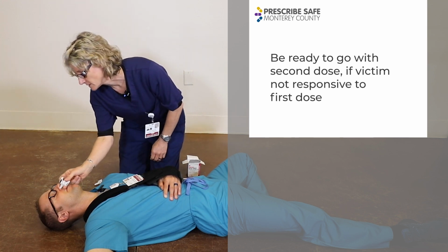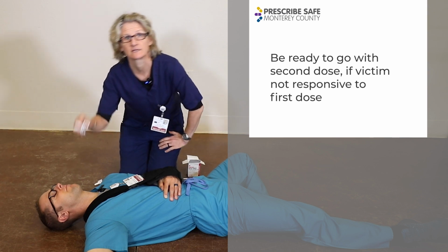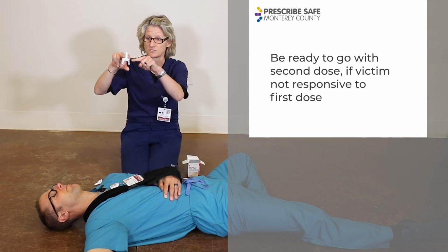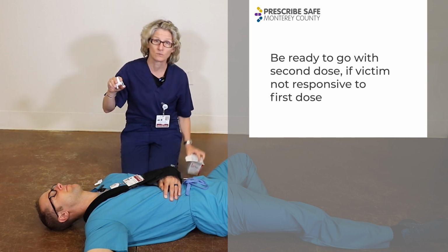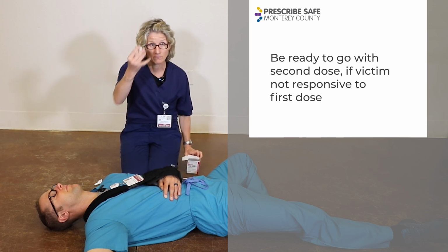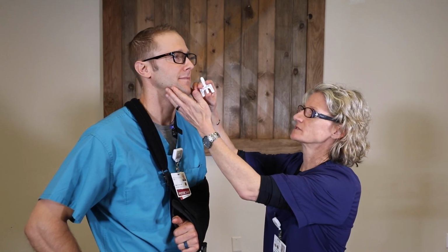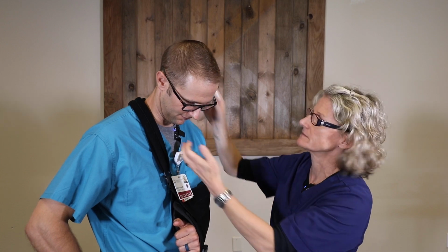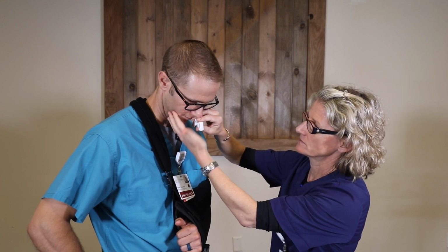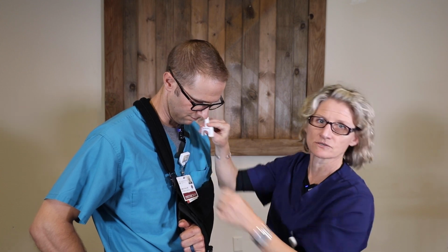And so you go in, you put it in until your fingers touch their nose, and push that second dose. And this dose, as you can see, has been used, and now you've administered both doses that were in your Narcan box, and 911 should be arriving about this time. So giving it to someone who's upright, say Casey is slumped over, right? If he's overdosed in a chair and he's slumped over, I put it in the nose, put it until my fingers are flush with his nose, and then administer the dose.